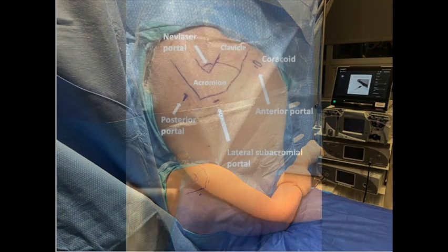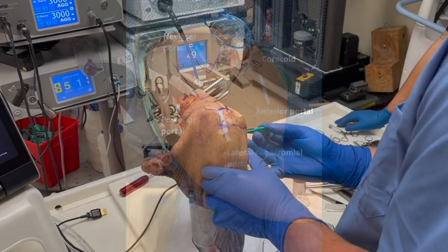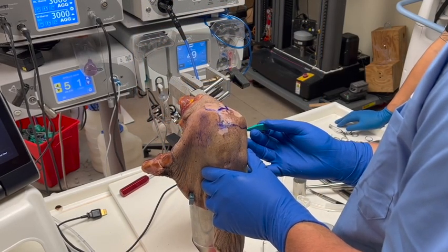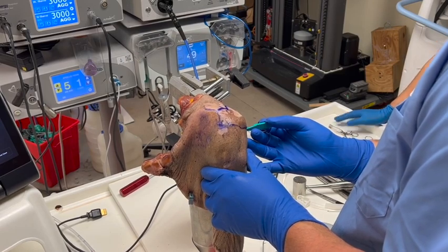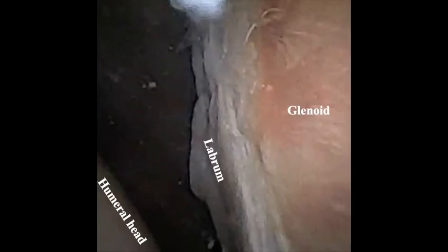Relevant anatomical landmarks are identified and marked, as well as the standard portal sites. Following injection of local anesthesia, a 2mm stab incision is made with a No. 11 scalpel to establish the posterior arthroscopic portal, which accommodates the 1.9mm zero-degree needle arthroscope.